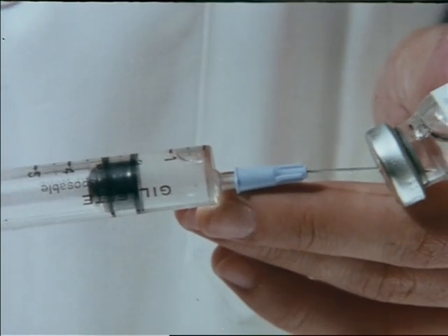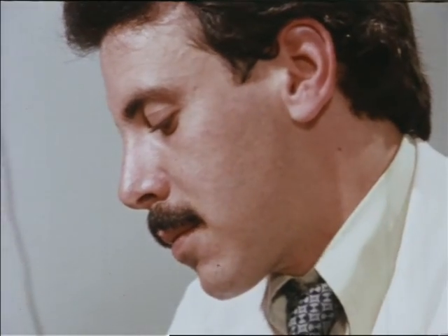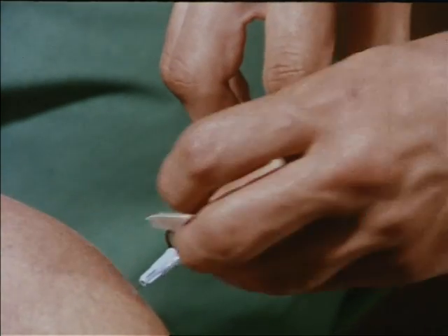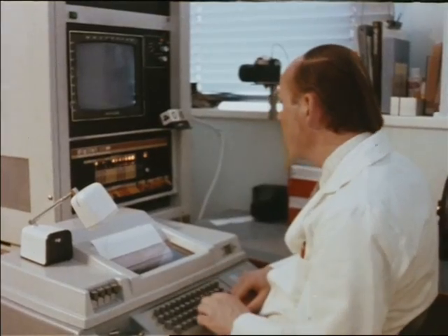The large amount of red shows the knee is very inflamed. A number of anti-inflammatory drugs are available, and thermography is being used to provide an objective assessment of how effective these drugs are. A drug is administered, and a day or so later, another thermogram is taken. The red area is considerably reduced. Compare this thermogram with the previous one.